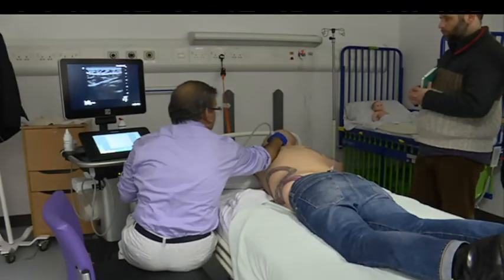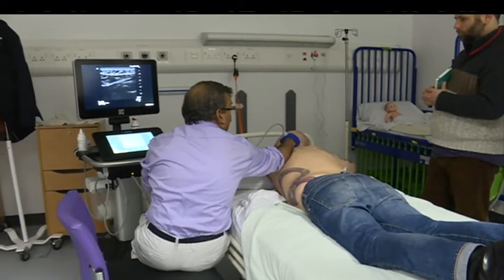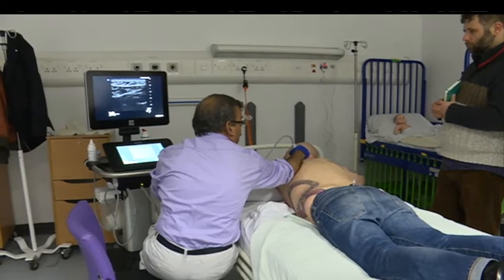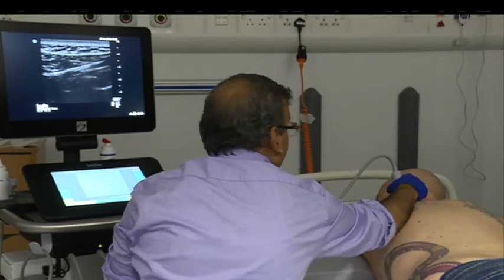With the ultrasound probe, the patient will have pain. Where you have rib fracture there might be hematoma or subcutaneous emphysema, so the picture might not be clear. So just go one level up — you will probably get a better picture cranially.